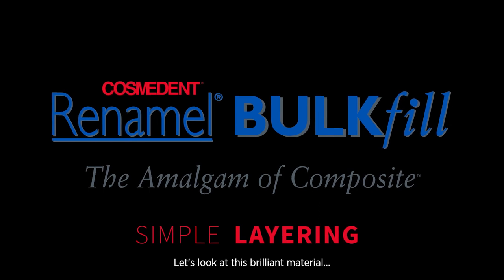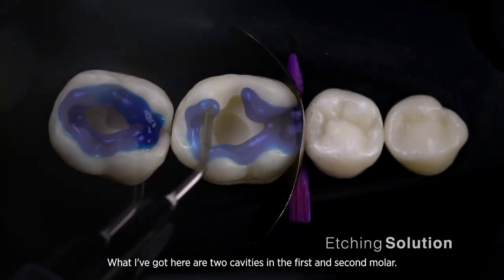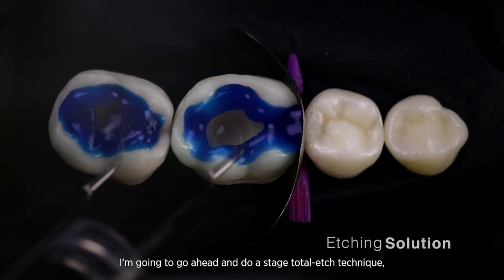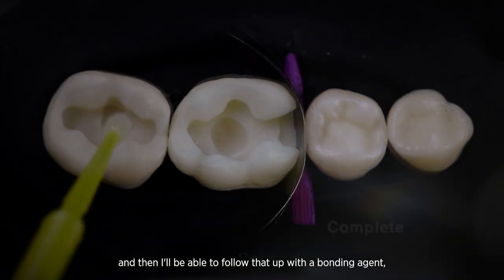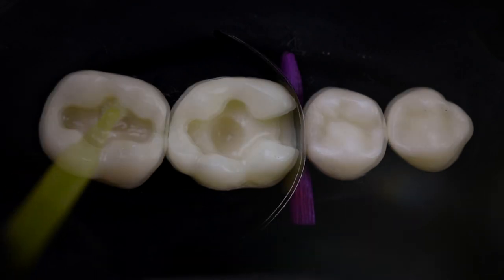Let's look at this brilliant material — it's Renamel Bulk Fill. What I've got here are two cavities in the first and second molar. I'm going to go ahead and do a staged total etch technique, and then follow that up with a bonding agent, something like Cosmedent Complete Bond.